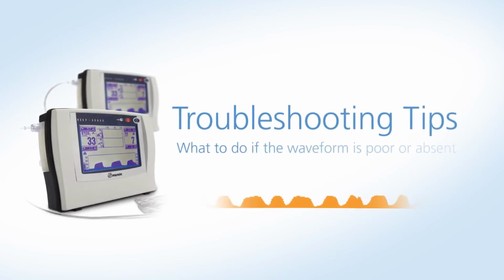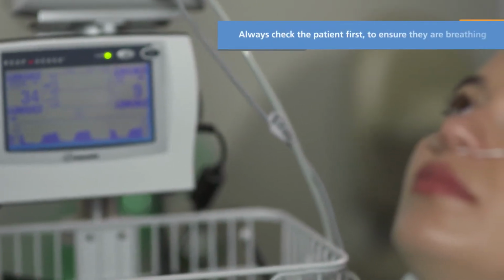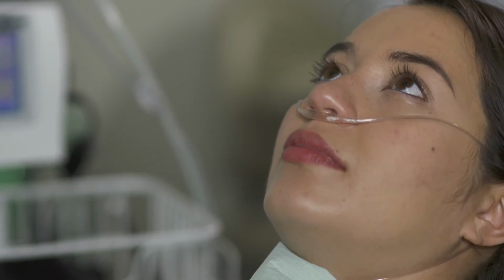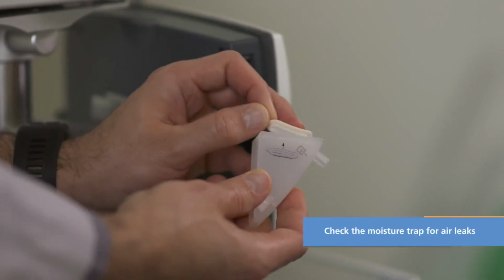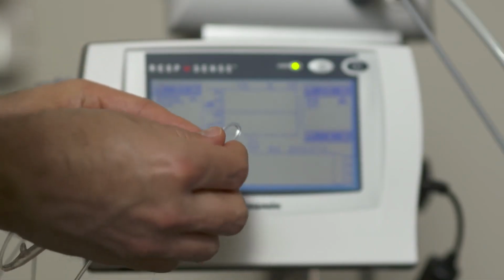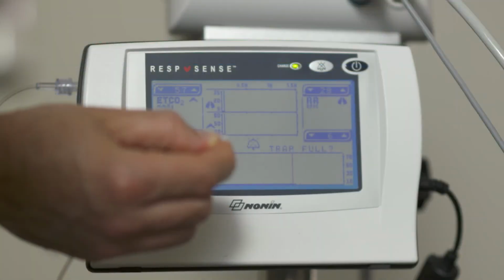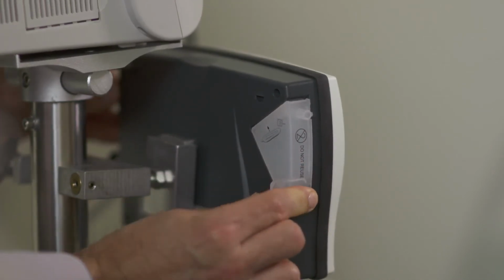Here are some troubleshooting tips if the waveform is poor or absent. Always check the patient first to ensure they are breathing adequately and the cannula is properly positioned on the face. If the patient is mouth breathing, there may not be sufficient airflow detected through the nasal prongs. Check the moisture trap for a secure insertion with no air leaks. Briefly pinching off the cannula should result in an occlusion message. If you can't occlude the cannula, the trap and filter may need to be reinserted or replaced.